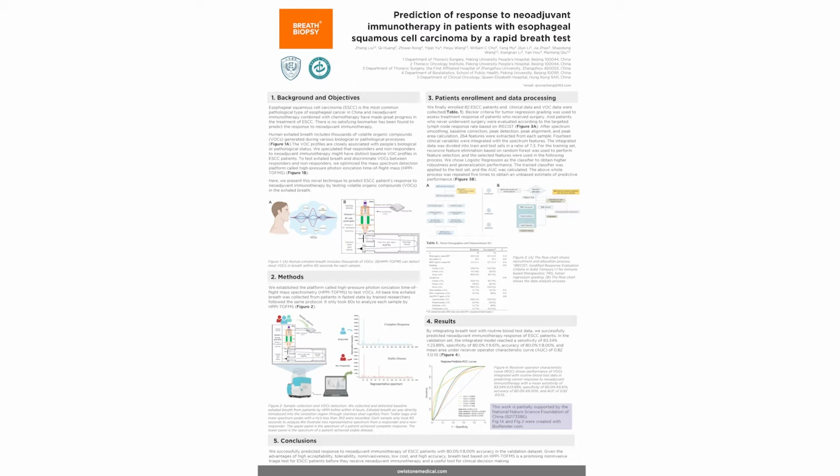To facilitate breath testing of VOCs, we have made substantial improvements to the high-pressure photoionization time-of-flight mass spectrometry, HPPI TOFMS. HPPI is one of the most powerful and popular soft ionization techniques. HPPI TOFMS is a direct and online mass spectrometry that ionizes air samples directly. Thus, HPPI TOFMS does not require pretreatment.